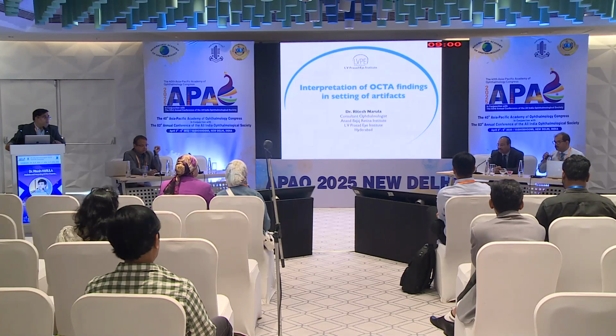Absolutely, it can empower us to even pick up preclinical diabetic retinopathy changes.